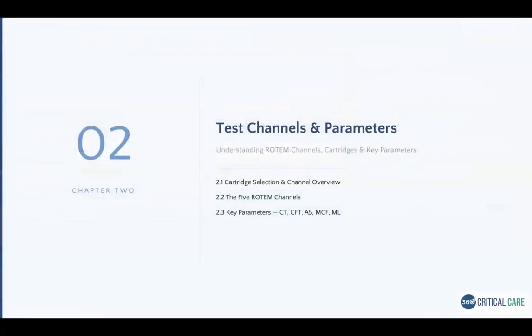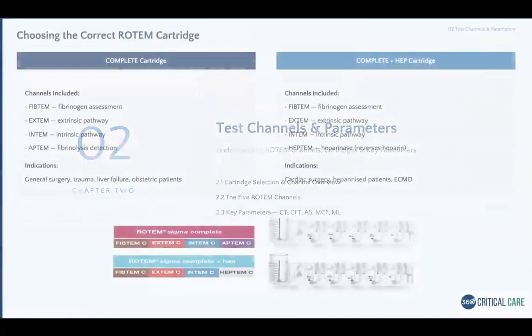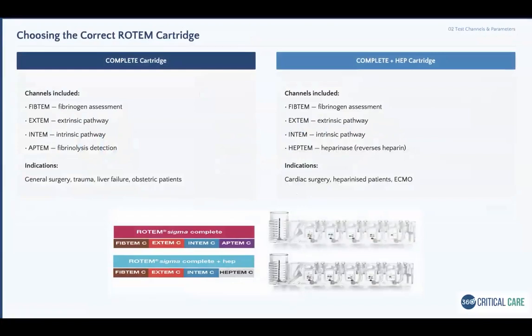That was a bit of an introduction about ROTEM and what the clinical scenarios are. Now we have two types of cartridges in the ROTEM. Basically, you run 5 channels.